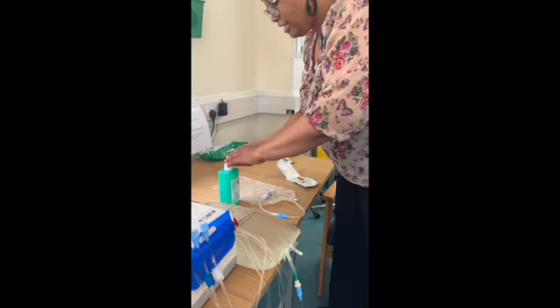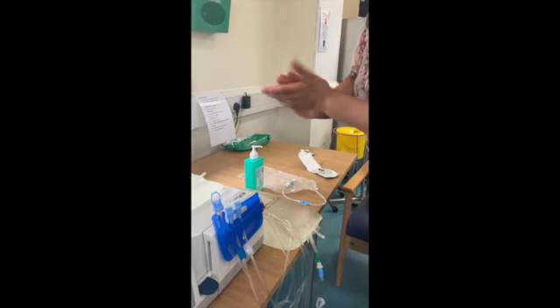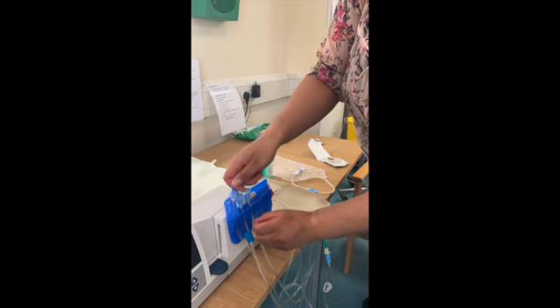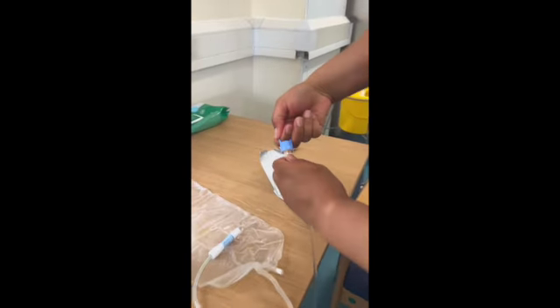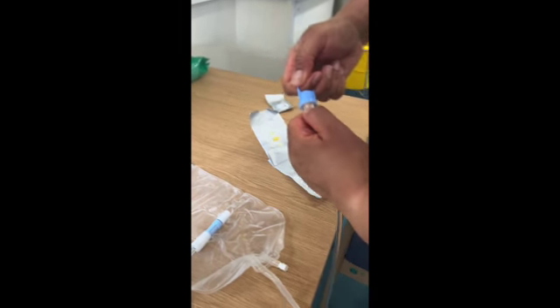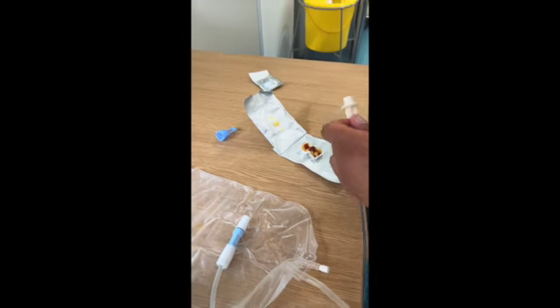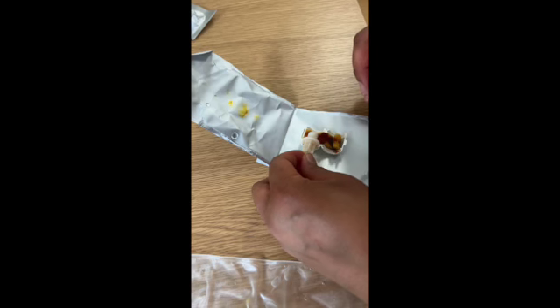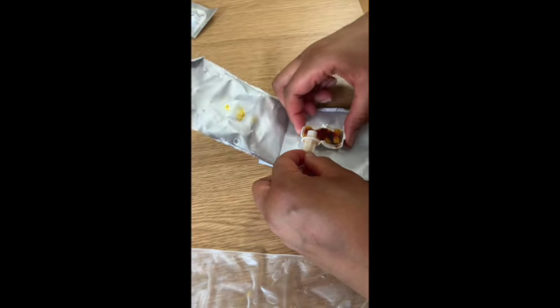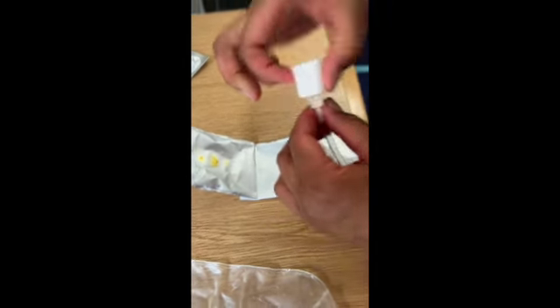I'm now going to gel my hands and connect the patient line to the shield. Again, being careful not to touch the inside. And then I've got to get this connector in the groove. Close it.